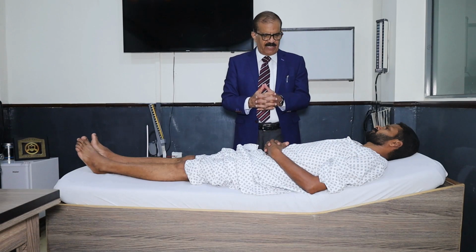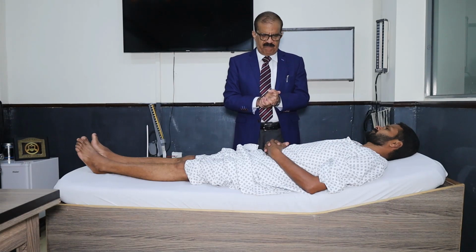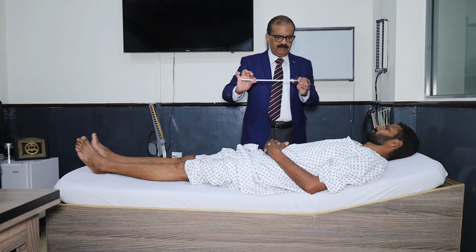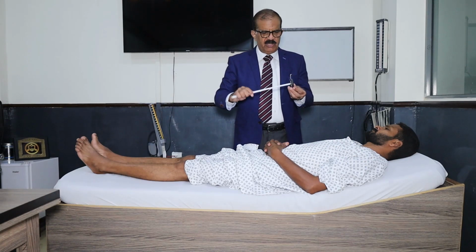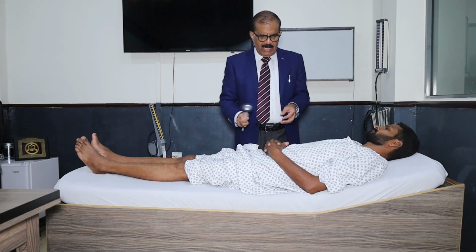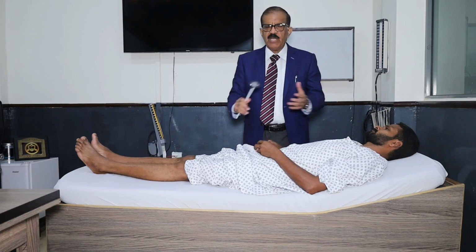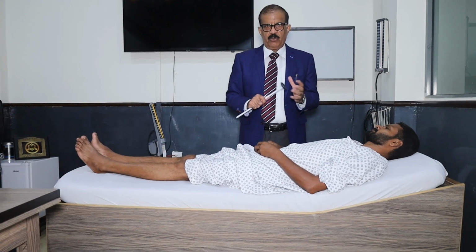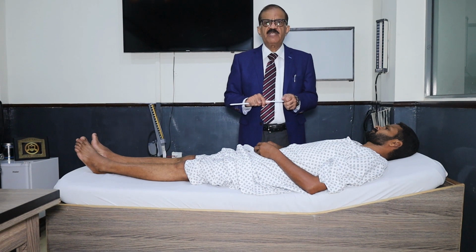There are two types of reflexes, the deep tendon reflexes and superficial reflexes. This video is about deep tendon reflexes. For that you need a reflex hammer, and there are two types. This is the conventional type, and I'm going to use this. It has to be tested on both sides. You need to develop proper skill to do it, because you don't want to unnecessarily harm the patient, because of course this is going to hurt a bit.